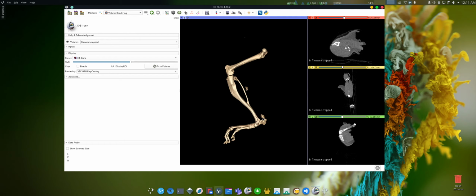And there is also a tiny bone over here which grows, which is part of this study. This is a very unique study which is focused on measuring the volume of this so-called ectopic bone. Therefore, we need to segment out the ectopic bone from the whole bone and calculate the volume of these ectopic bone fragments.